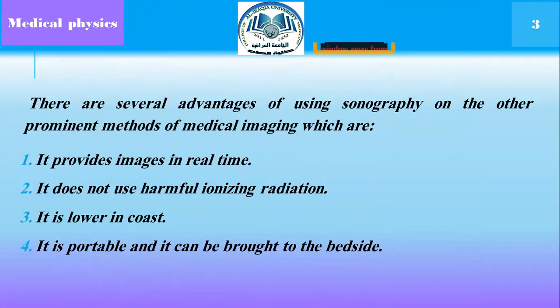One, it provides images in real time. Two, it does not use harmful ionizing radiation. Three, it is lower in cost. Four, it is portable and it can be brought to the bedside.